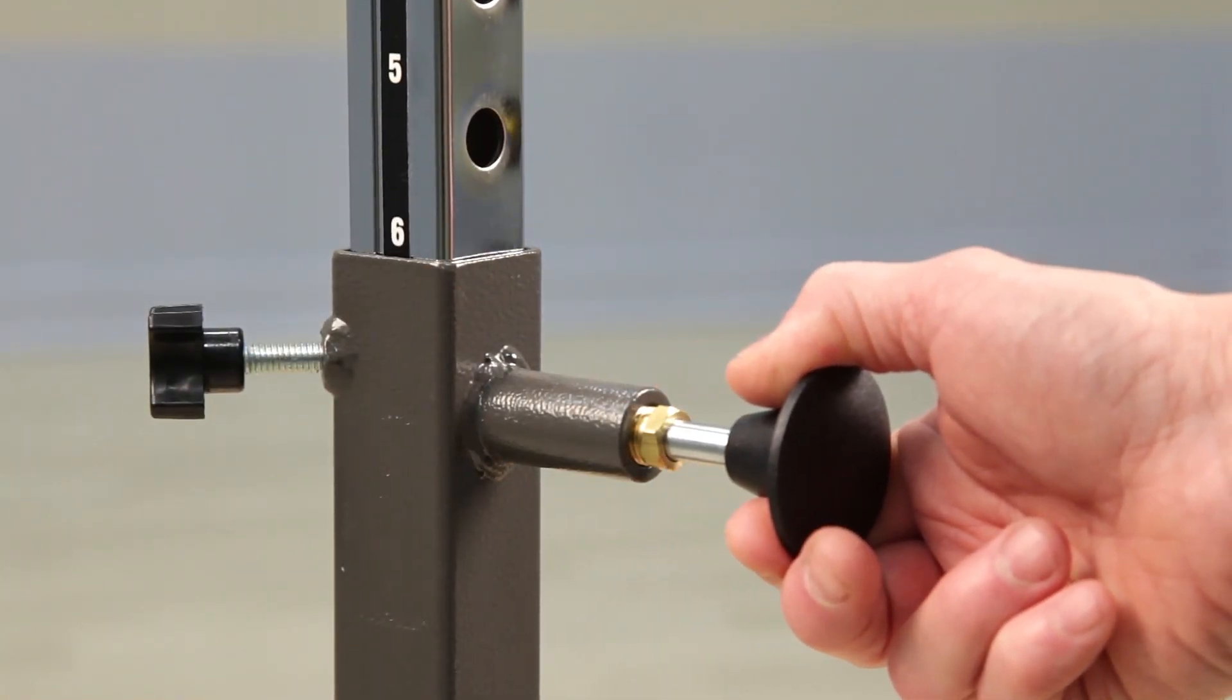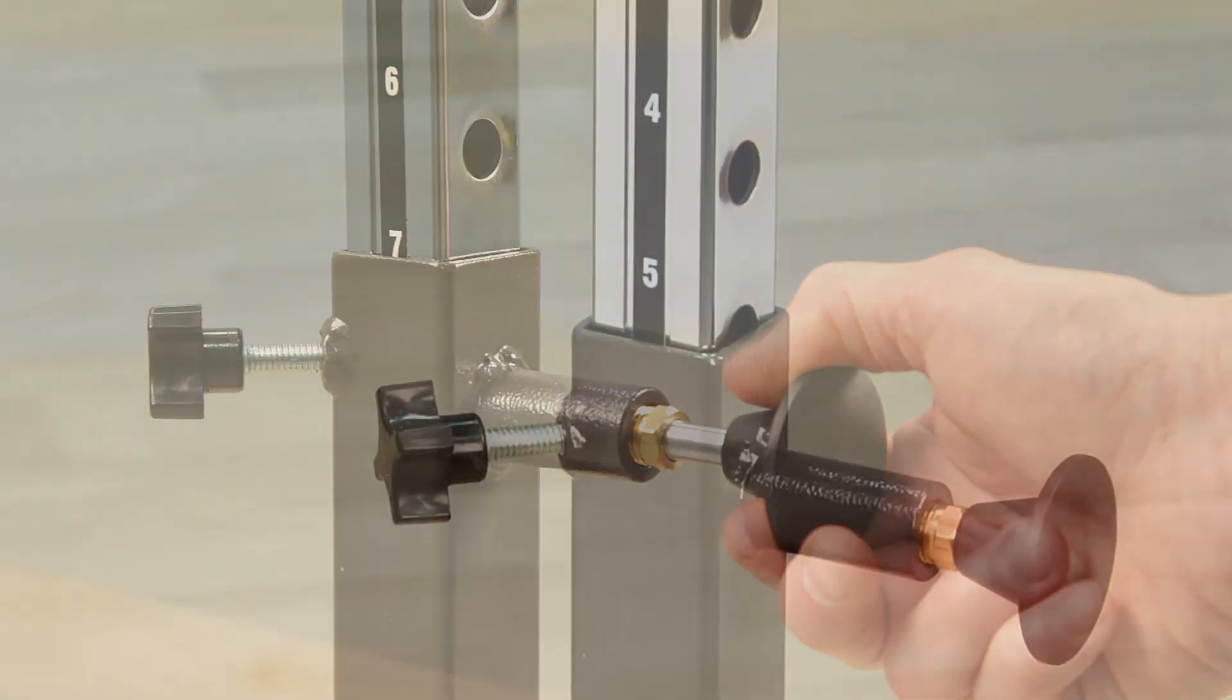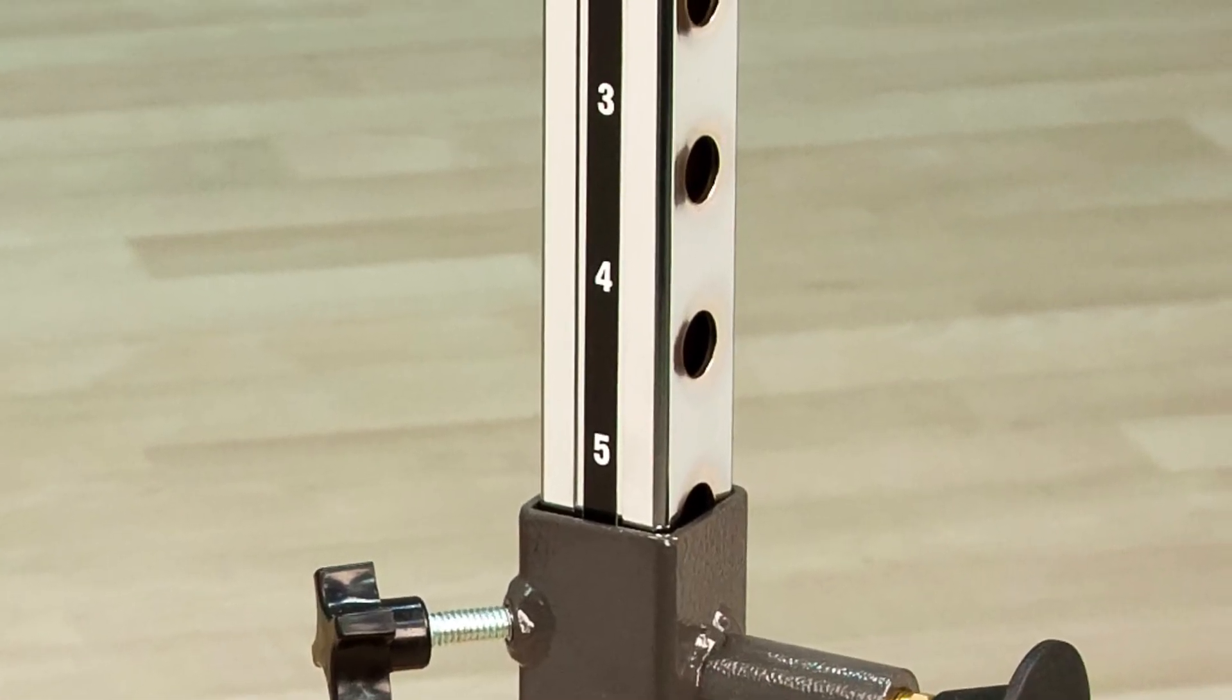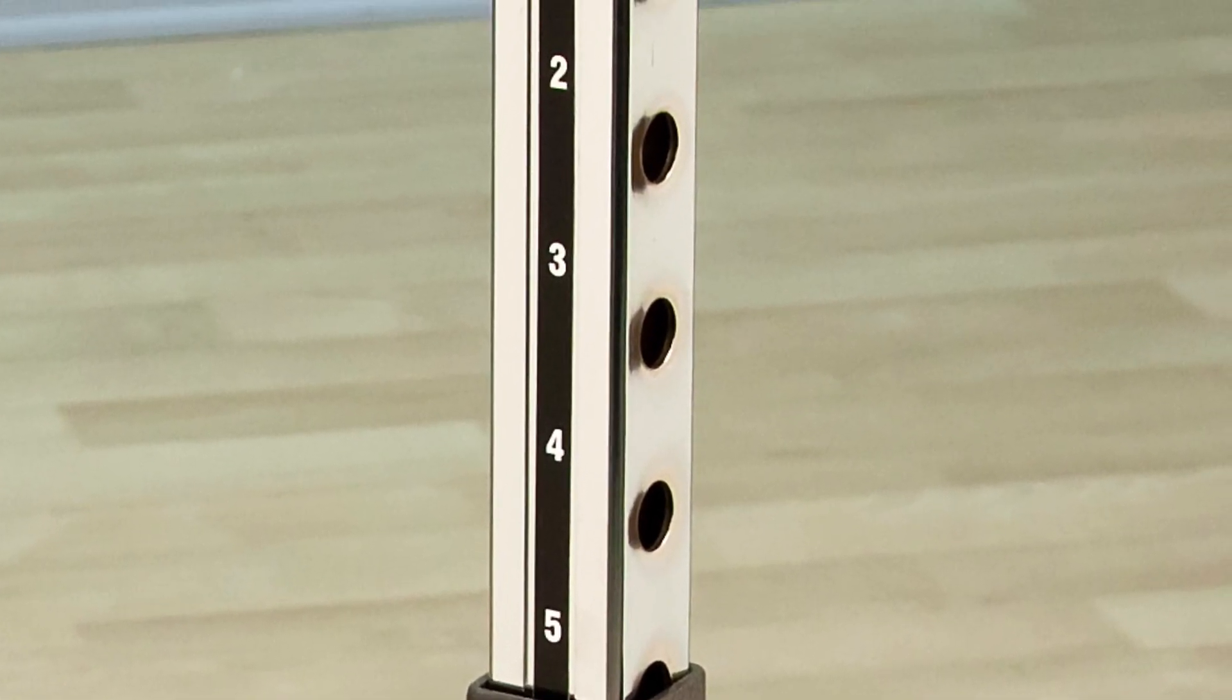Adjust the height of the handrails with the spring loaded plungers which are clearly numbered so both ends and both bars can be set to any height quickly and easily.